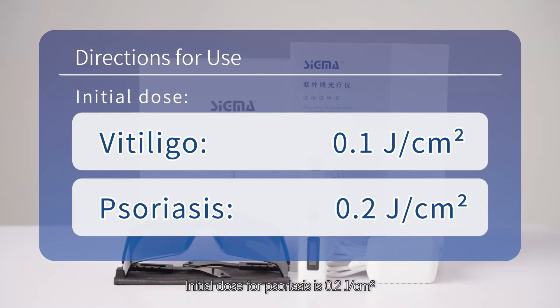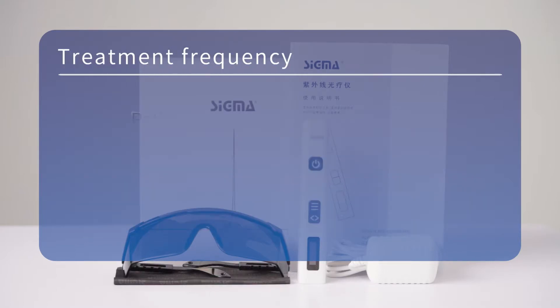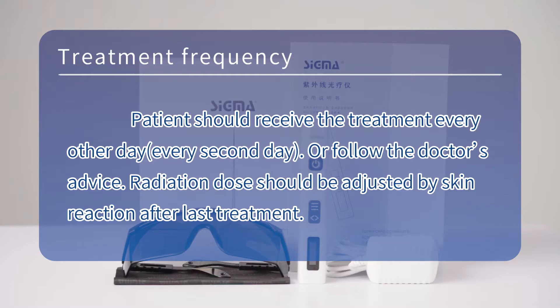The initial dose for Psoriasis is 0.2 joule per square centimeter. Patients should receive treatment every other day or follow the doctor's advice. Radiation dose should be adjusted based on skin reaction after the last treatment.